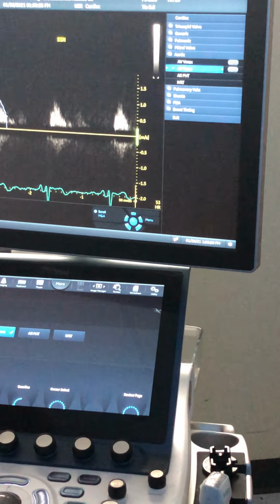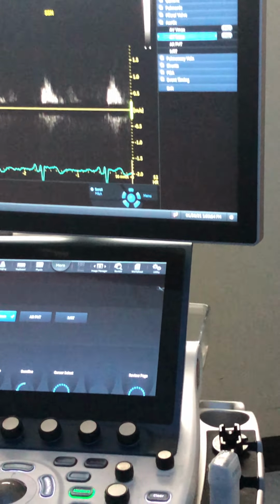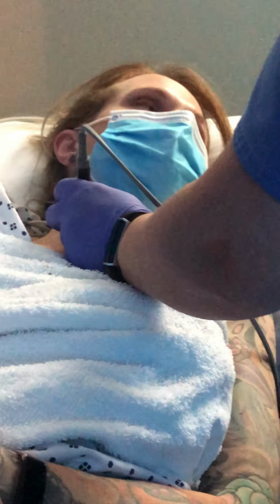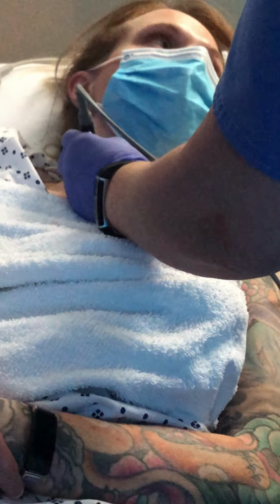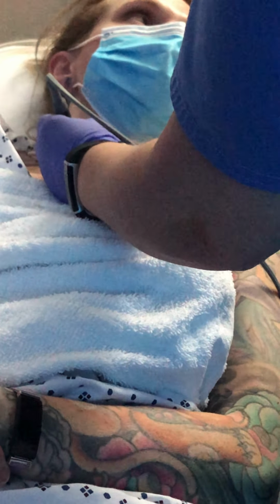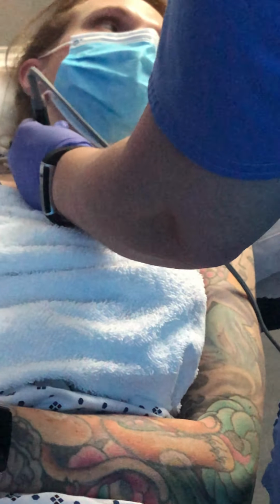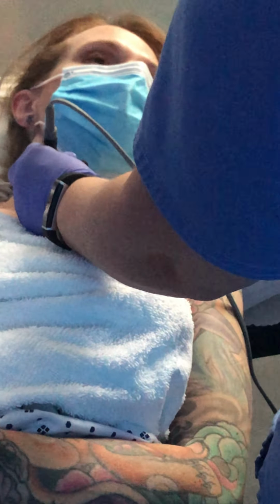I'm gonna put this here first before I take it off freeze. I'm going to aim it towards my ascending aorta, so putting it in my suprasternal notch, real gentle here. See how I'm going above the baseline, and it's really light here, so it's mainly above the baseline. I can turn it and see how now this is bright. And I'll know where I have it too.